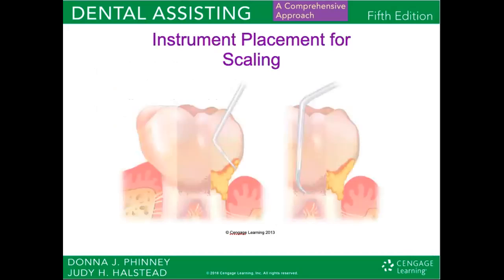And here we just see an example of instrument placement for scaling. And that's just one example of the different places where they usually are placed to scale off a lot of this debris that you see on the tooth here.